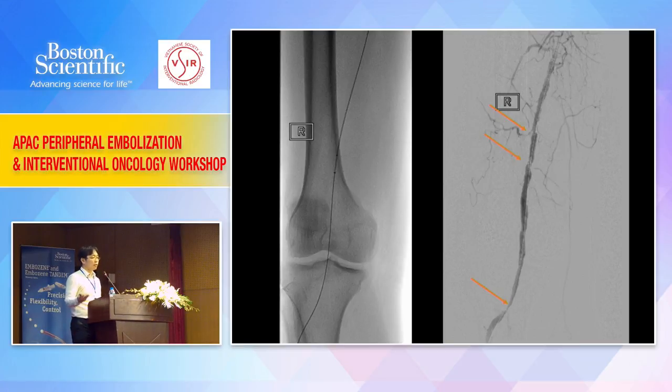Okay, it cannot be possible that the entire artery from the bottom of the stent to the tibial peroneal trunk is completely occluded. It's just not possible. There must be some underlying issue that causes it to completely block off. And once you remove all the soft clots, then you see all the hard plaques. And you can see very clearly where the 3 arrows are, the areas of the offending lesions. So you need to get rid of all these lesions, all right?